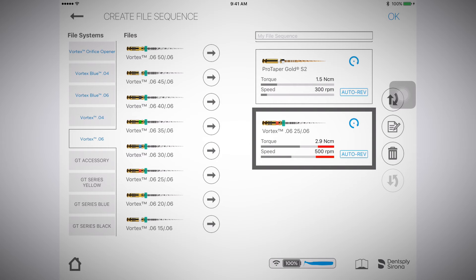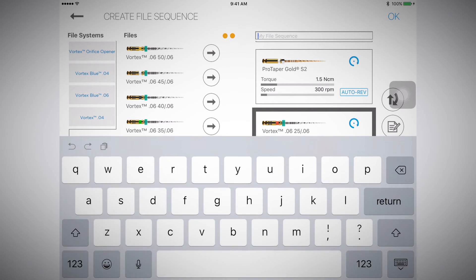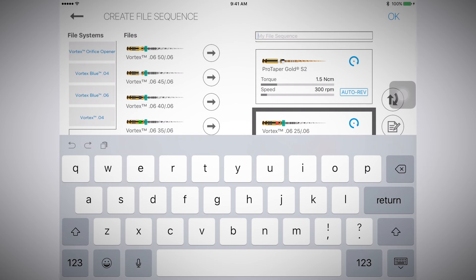Now that I am finished building my file sequence, I need to name it. I do that by selecting the My File Sequence box at the top of the page. I'll name it Test for demonstration purposes. Now select OK.